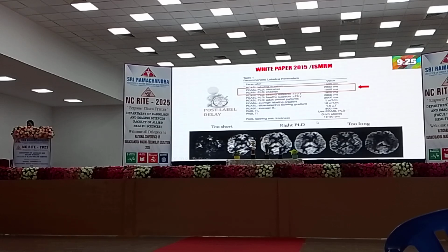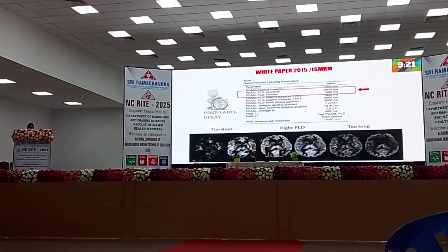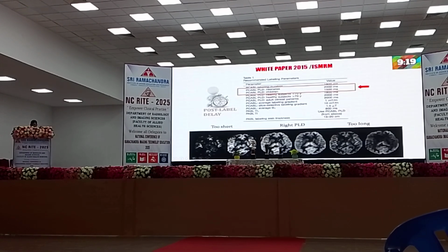So this is the standard protocol for PLD. You can see the image over here. With the right PLD, it shows a nice image where the perfusion is very good. But if too short or too long, it will show hypoperfusion. So always remember, for each individual patient, you have to select the PLD.